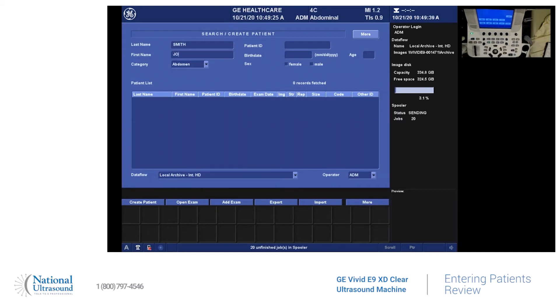Last name, first name, a patient ID, birthday, and you can select male or female. And you can also here select your category.